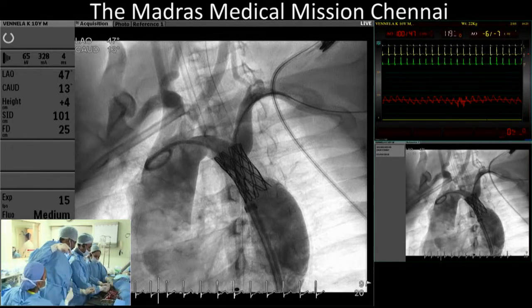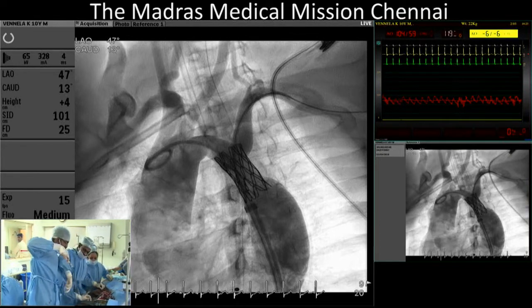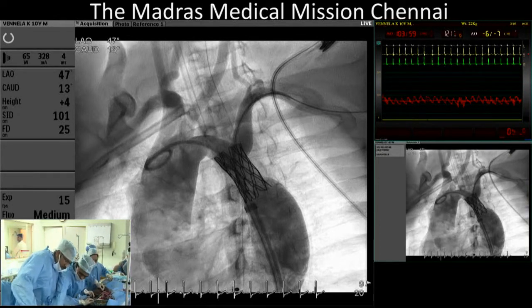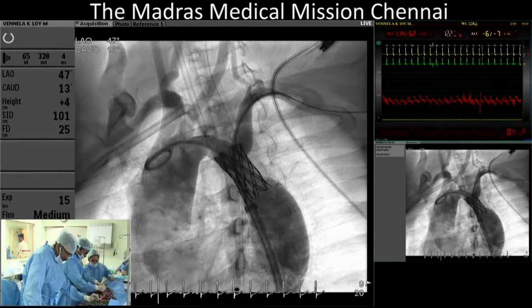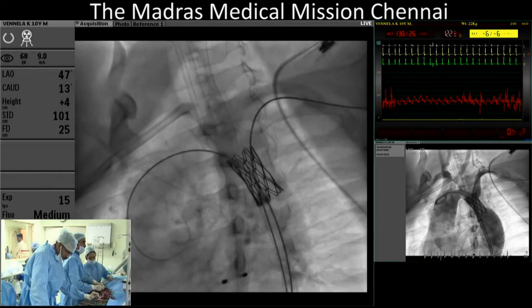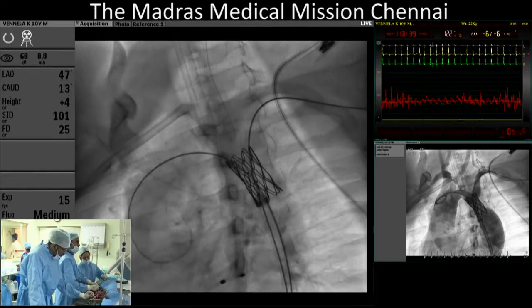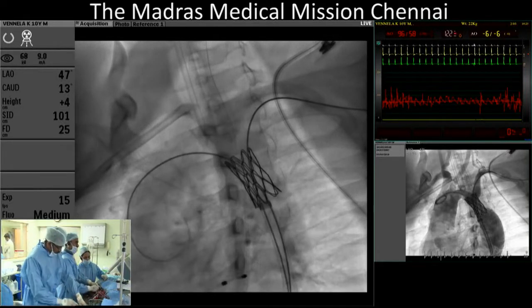90% of surgeons, if you do a poll, they'll say do intervention. So you have to accept, even if you achieve a perfect result, hypertension is a chronic problem, whether it's hypoplasia or just resetting of receptors. So this patient, you've got a good result with stenting. Arch is hypoplastic, treat hypertension.